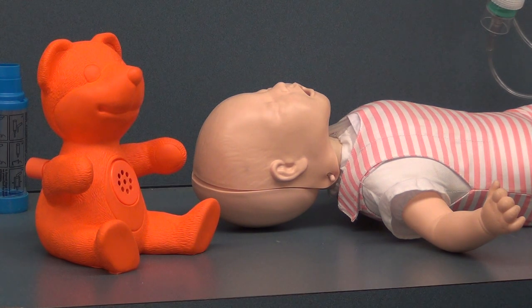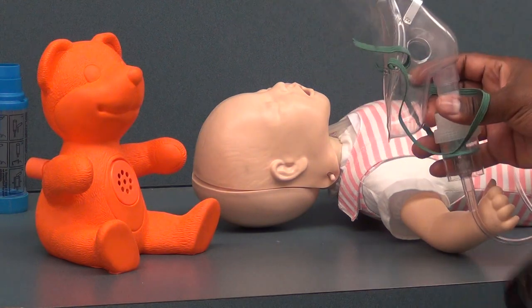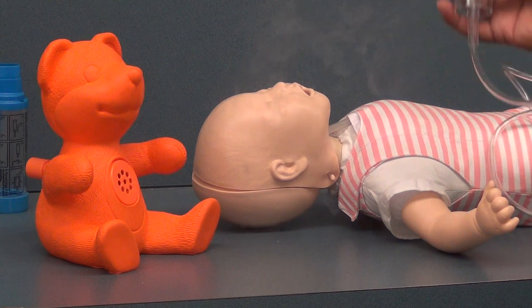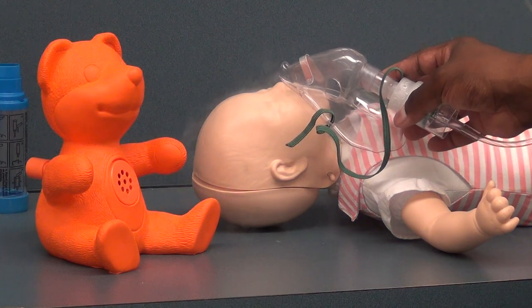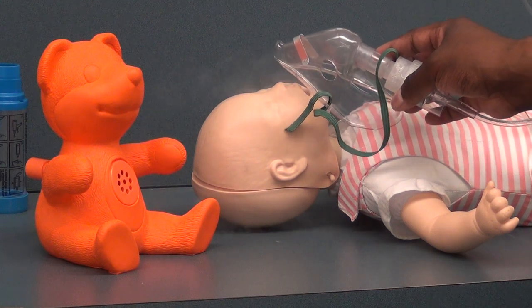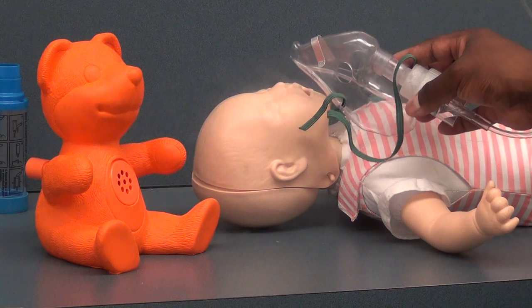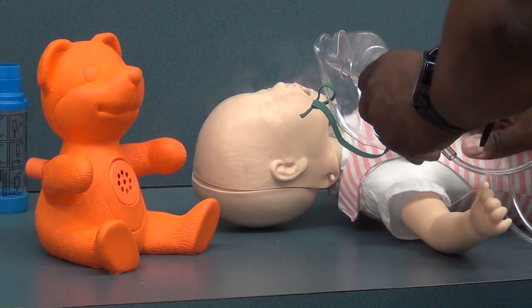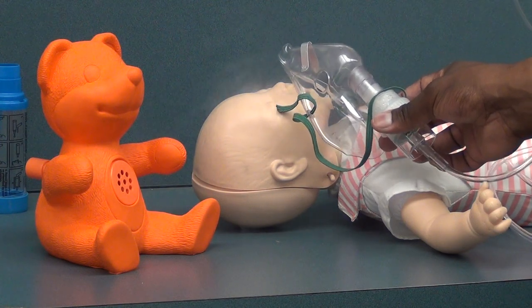Turning on the flow meter to about 7 liters per minute — notice I have a good mist for my patients. The blow-by method involves time and patience for the clinician. We just take our medication and hold it as close to the baby's mouth and nose as possible. Now, this may cause some patients to cry — just remember that a cry is a long exhalation, so the patient is not really going to benefit. The primary concern is to soothe the baby: let them hold your finger, stroke their chest and abdomen, and reassure them so they can benefit from the treatment.